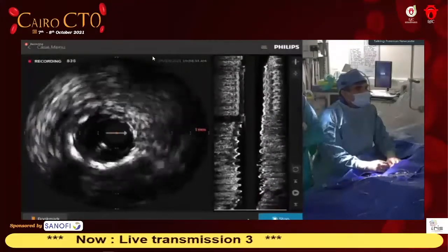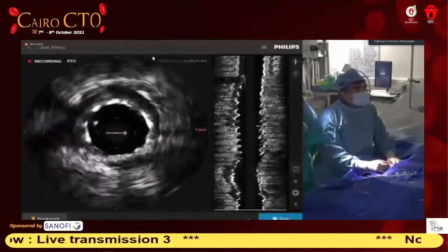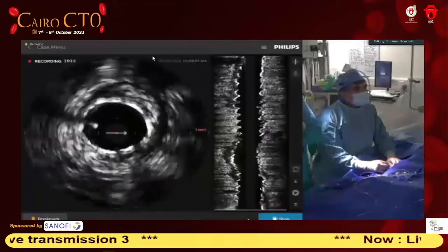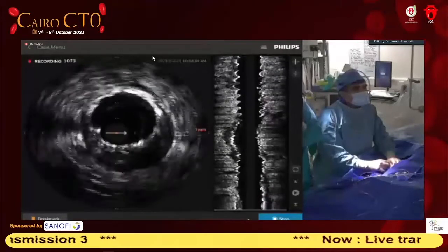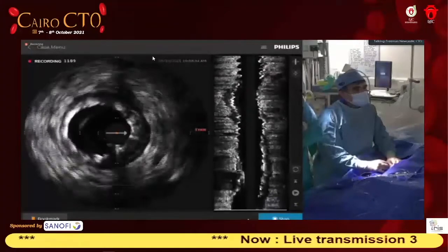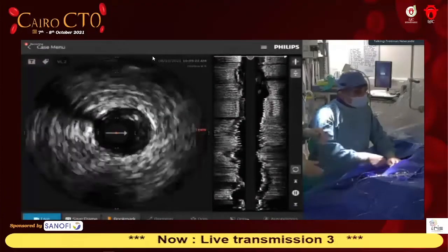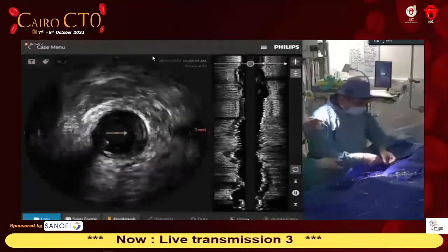Yeah, the thing is, the right coronary artery is like a tube, and the diameter really doesn't change much until it bifurcates. So 4.0 is very good. Whoever's doing CTOs or anything, yeah. If you see it at 4.0, yeah. But I said, for me, the eccentric calcium was the main thing for me to decide to go smaller branch.